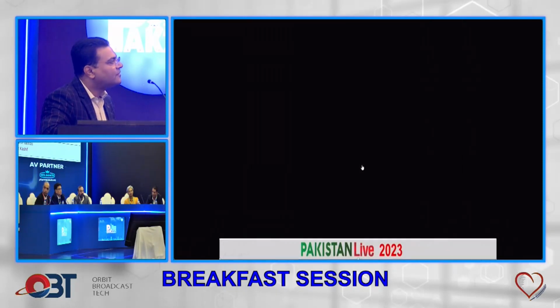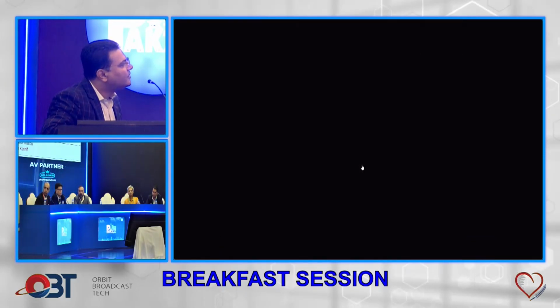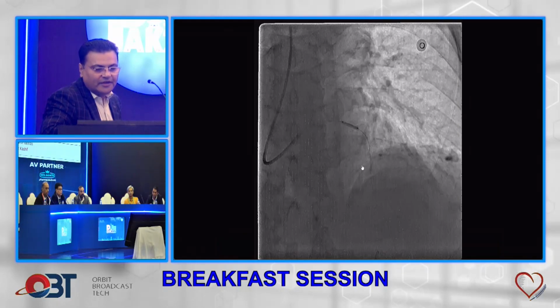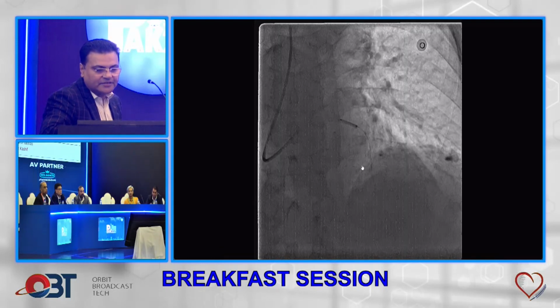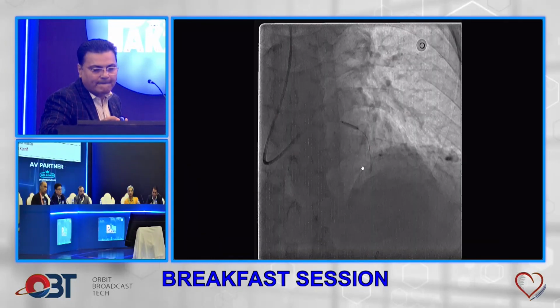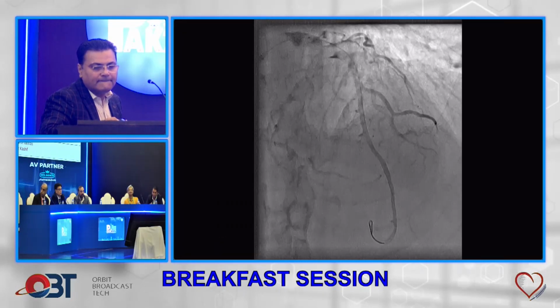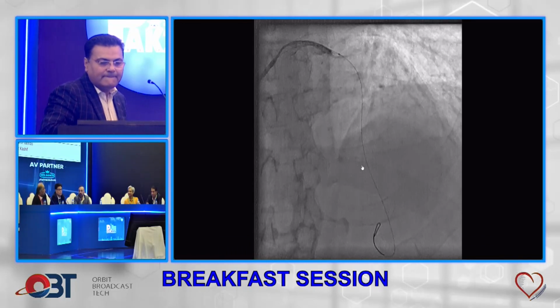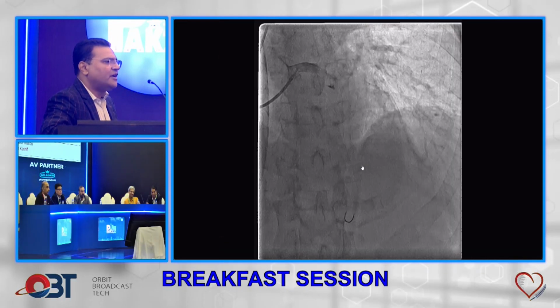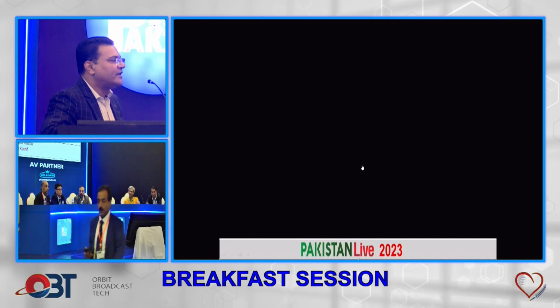And when you had the wire in, was the flow established? Because many times in acute cases, just taking the wire in makes the flow come back. Yes, so after ballooning at the lesion with the 2 × 15 at nominal pressures, so what do we see next? So this is the establishment of the flow. Yes, flow was established. It's TIMI 1 to 2 flow with a huge clot burden. So, to the panel, what's the next plan?